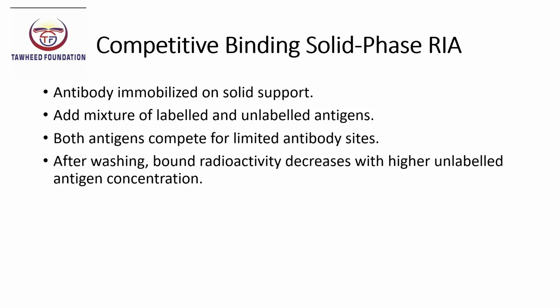A mixture of radiolabeled antigen and unlabeled antigen from the patient sample is then added to the system. Both forms of the antigen compete for the limited antibody sites. Following incubation, the unbound material is removed through washing. The bound radioactivity remaining on the solid phase is then measured.